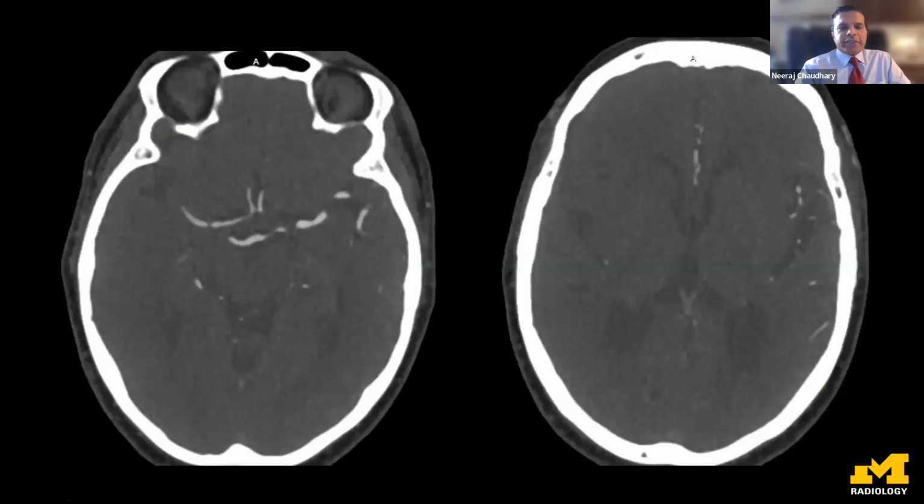If we get the ASPECTS score from the non-contrast CT head, how do we confirm that there is a large vessel occlusion? CT angiogram, very easily available. The CT scan resource is available across the world, very easily tapped into at most hospitals. Most emergency departments will have CT scanners which are capable of processing CT angiograms. So intravenous contrast is given, and timed bolus chased arterial phase scans are done to identify large vessel occlusion.